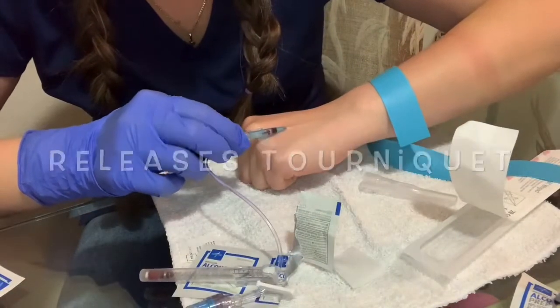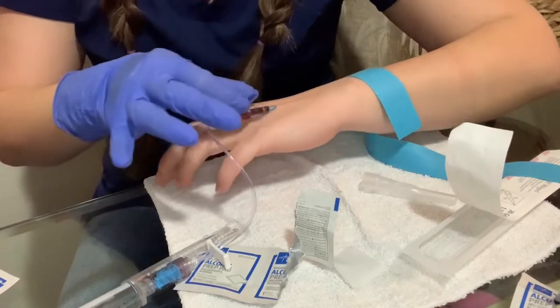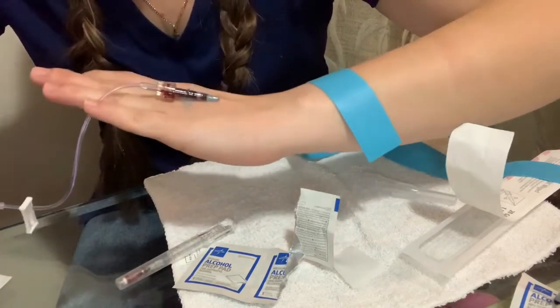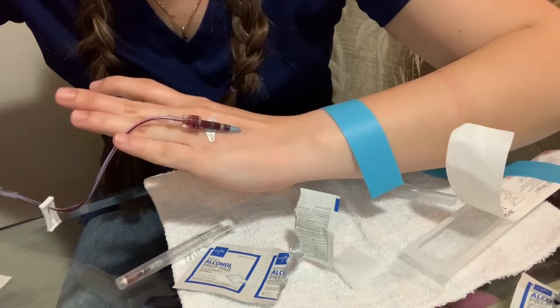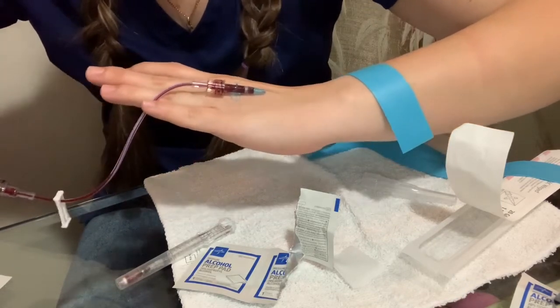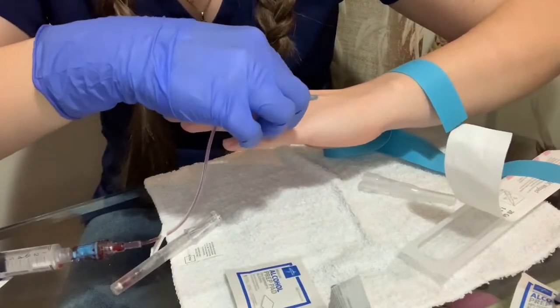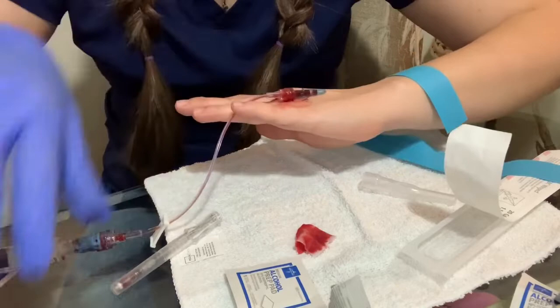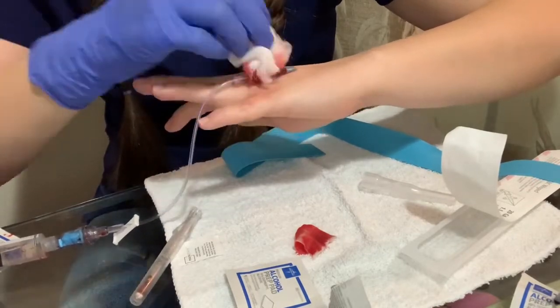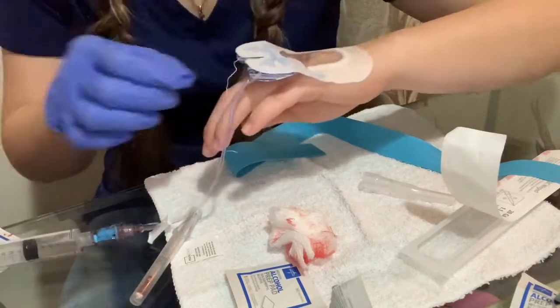Now I'm trying to advance the catheter — I'm successful. I put the needle in safety, and now I'm gonna try to connect the extension set, which is very difficult with one hand. Now I'm trying to flush it, but first I'm gonna try to get some blood back to make sure I'm in the vein. I can see the blood coming out. If that happens, it's okay — you just have to clean it, get that IV in place, and put the dressing on as soon as possible so the IV won't come out.